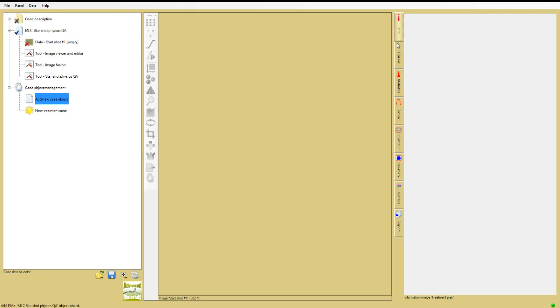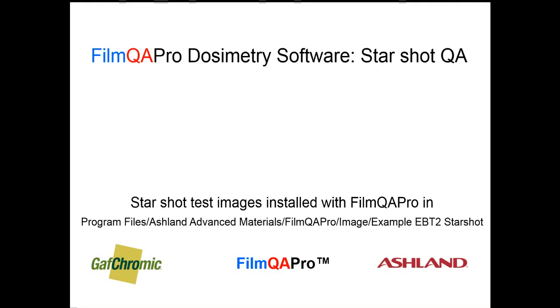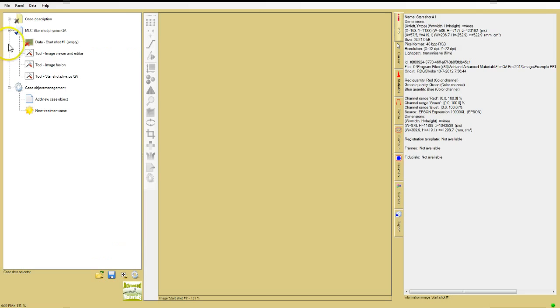An image may be loaded in two ways, either directly by scanning or by opening a saved file. In this example, you'll load a starshot image from one of the folders included in the FilmQA Pro installation package.